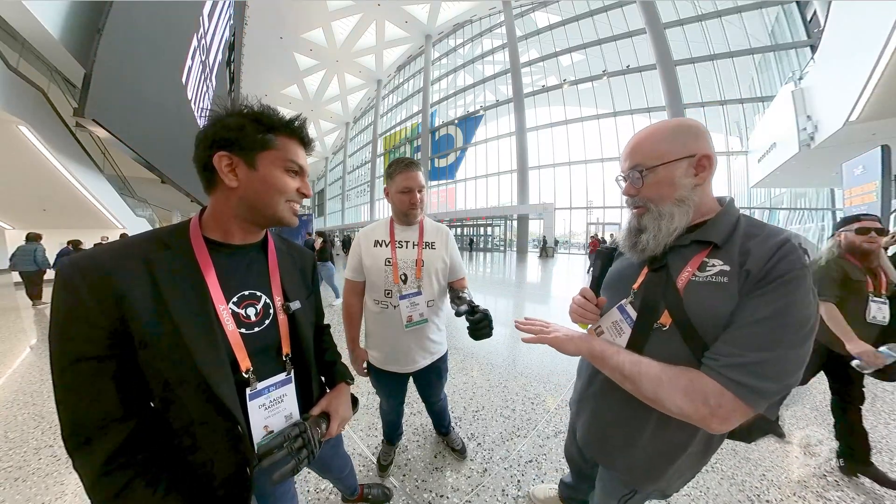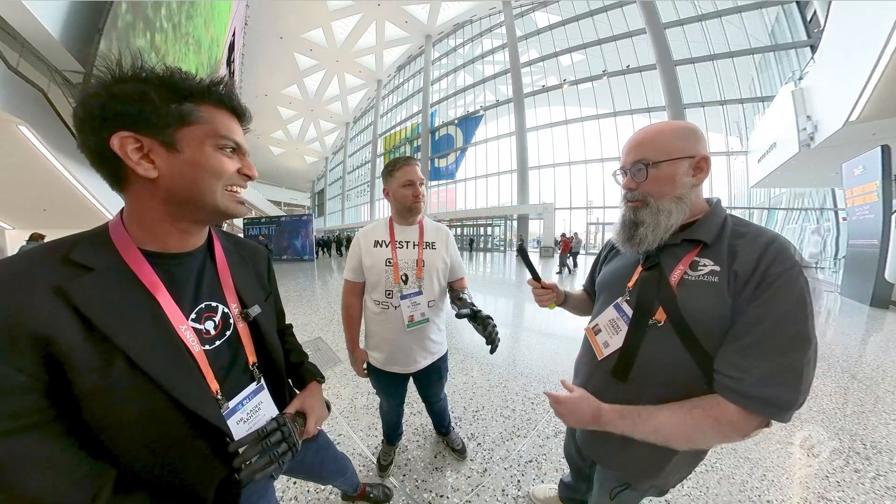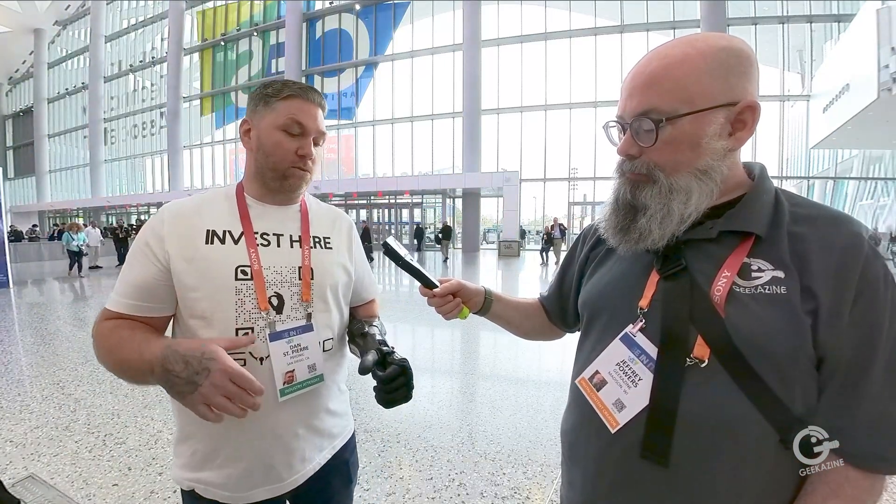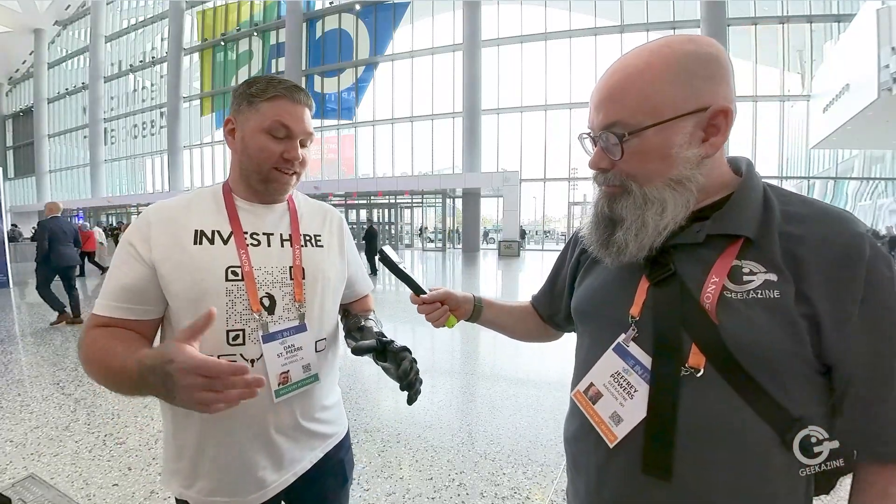So you're wearing it — how does it feel? It feels really good. It's a lot lighter than any other hand that I've worn in the past. A lot quicker, more durable. We break boards — I wear this thing to work out. I beat it up and it keeps going.